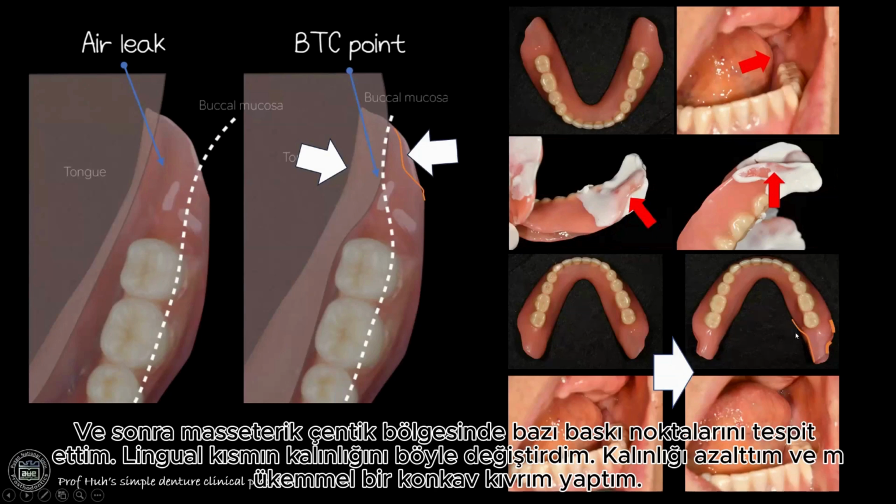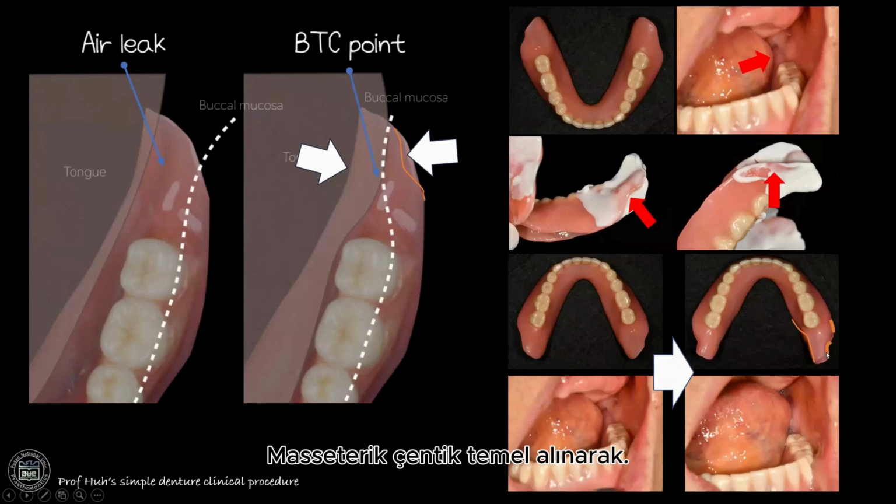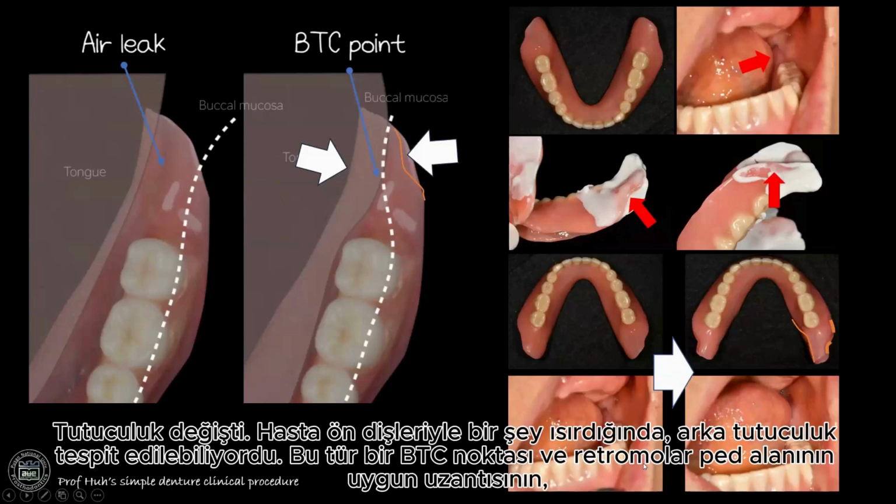I reduced the thickness, and then I made a perfect concave curvature based on the masseteric notch. At that time, I could see the BTC contact point. The retention had changed, you know.